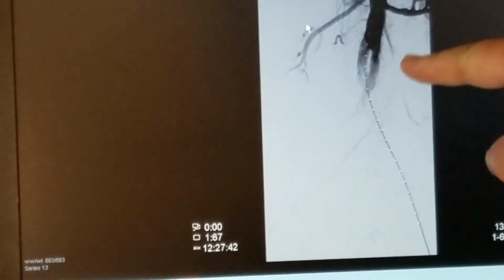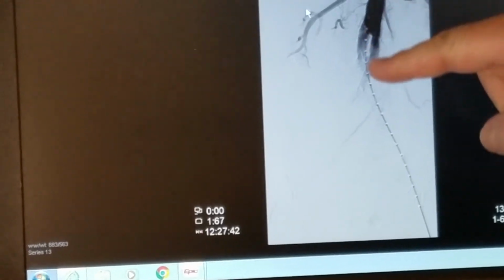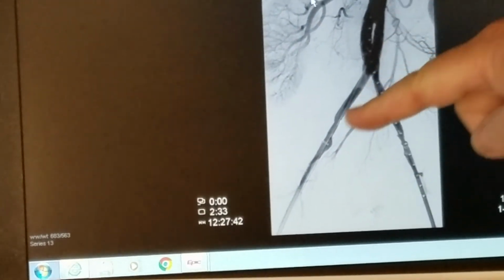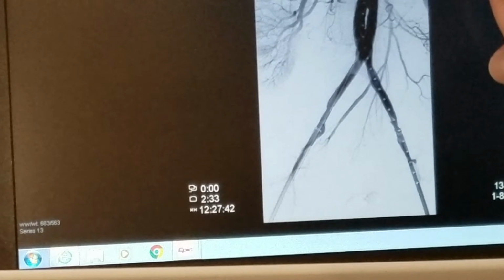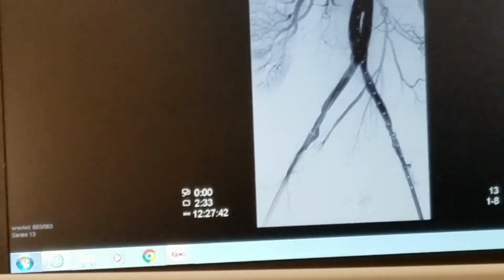So basically, this is where the bulge with the inflammation was, and this is basically putting a wire pair of pants. Now we cross the limbs because she's kind of small and petite, so the limbs kind of cross, but that's a normal configuration. And you can see that everything from here up is artificial graft, but we were able to exclude the bulge here. Oh, I see. And so that's after the stent's in.